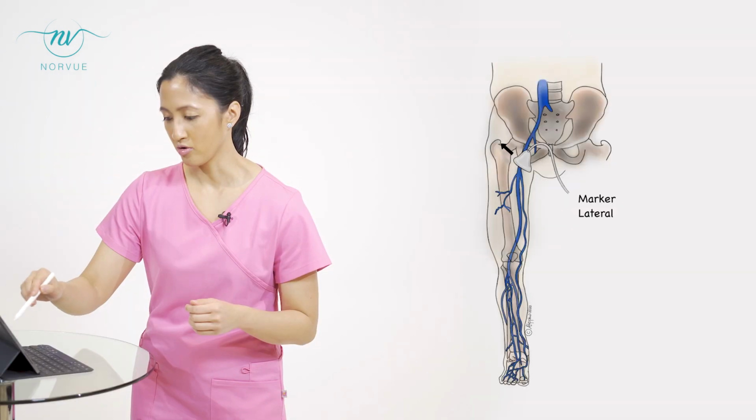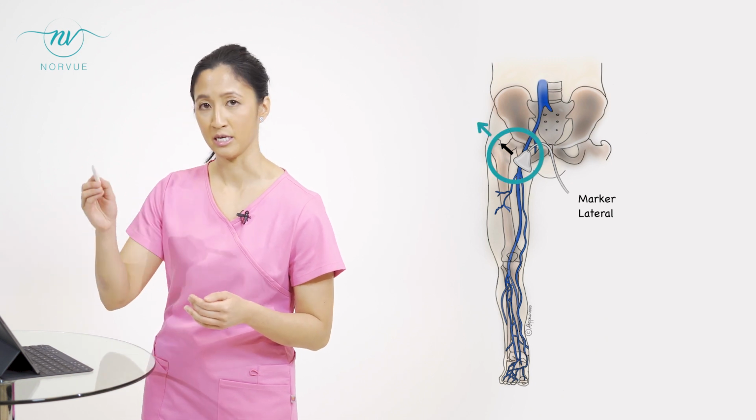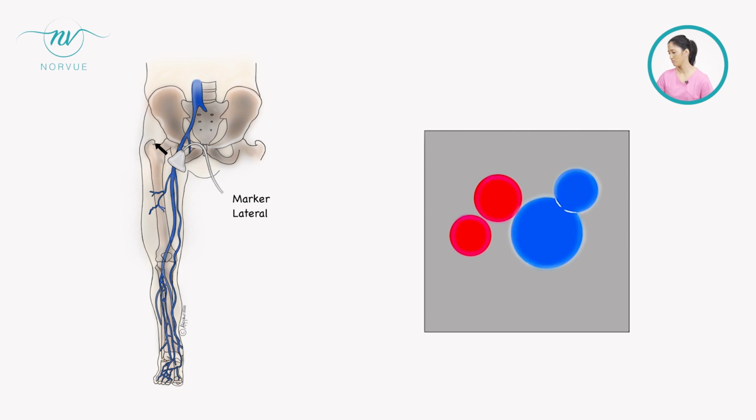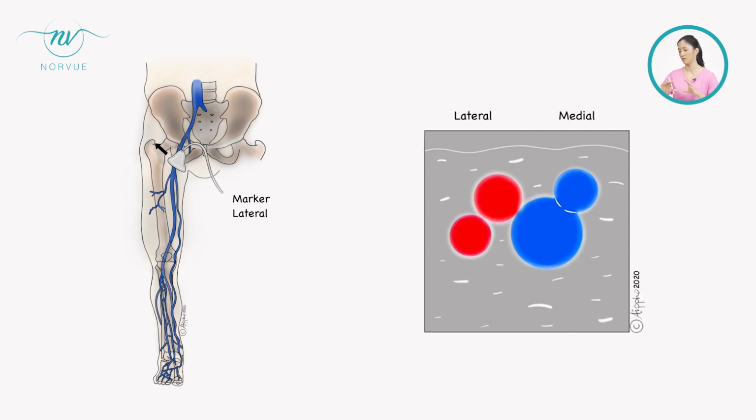And then we start moving below the common femoral vein. The pointer of the transducer is still pointing laterally for the patient. So now you see the part where you see the bifurcation from the common femoral vein, where you see the great saphenous vein in the picture. So this is the sonoanatomical illustration at this level.